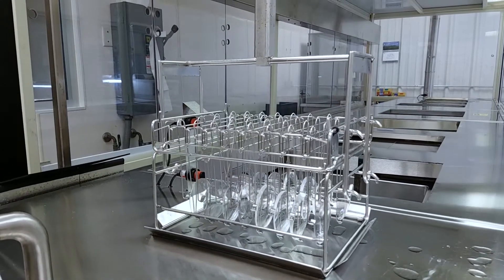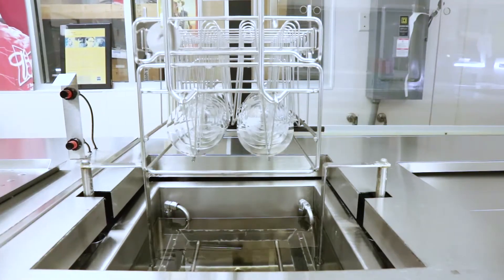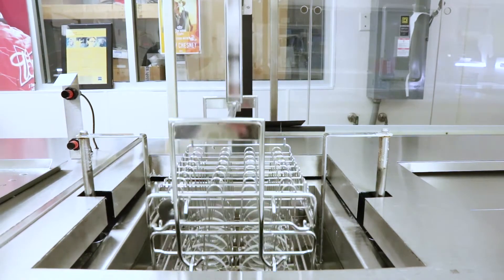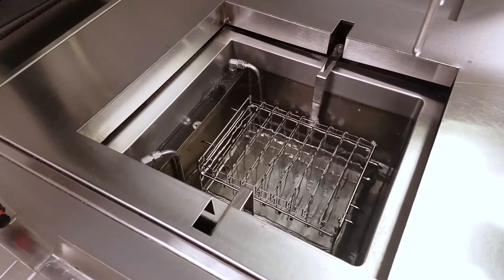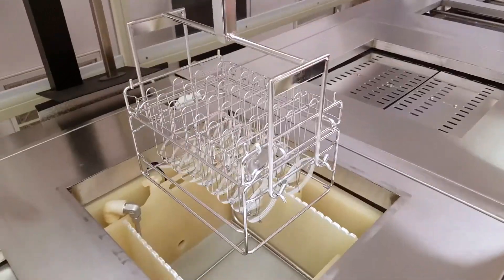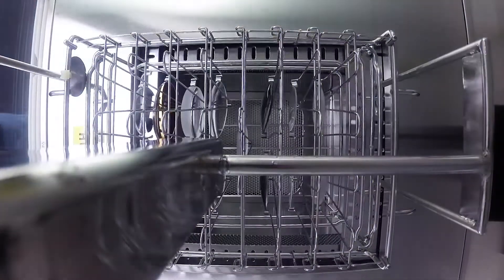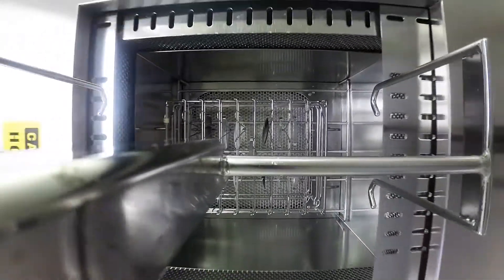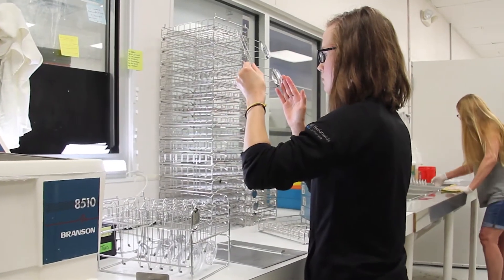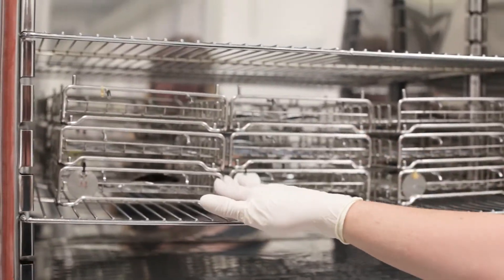Next, each lens receives a thermal hard coat or thermal-cured scratch-resistant coating. This is a ten-step process that requires about 28 minutes. The steps are etch, spray, bath, dryer, activator, activator cure, foundation application, and pre-cure. The lenses will now be inspected for any flaws in the thermal coat process, and then move into the final curing rack, where they will remain for two full hours.